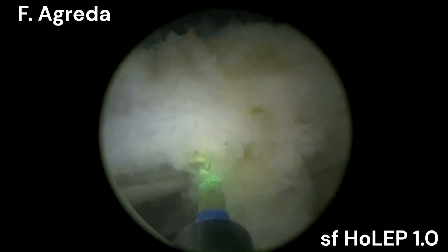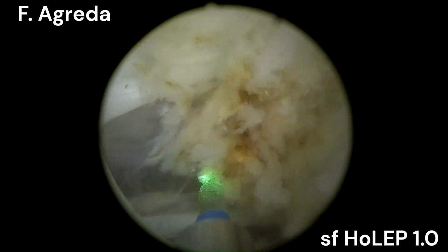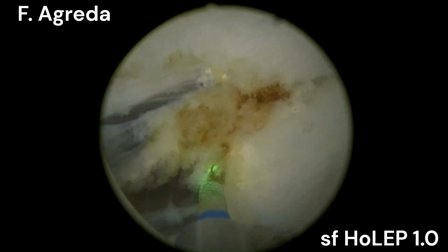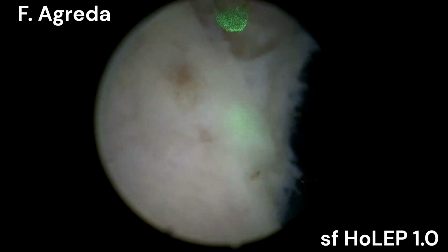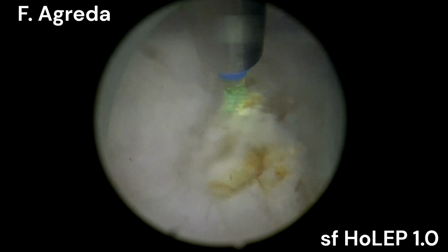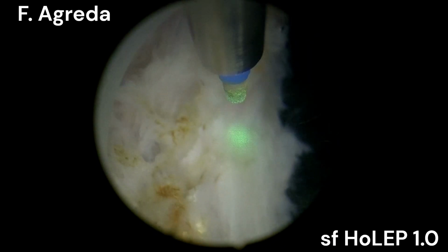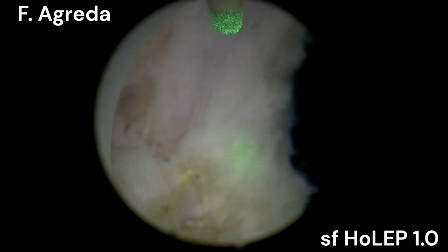I will cut it down, and you can see that even when I was very cautious with the dissection, there are some parts of the capsule that are very thin, and I'm even showing some fat tissue. So it's like a grade 1 perforation, not a complete free perforation. It was a grade 1. It's probably because this was a very sticky adenoma. I'm guessing it's because of the prostatic artery embolization.